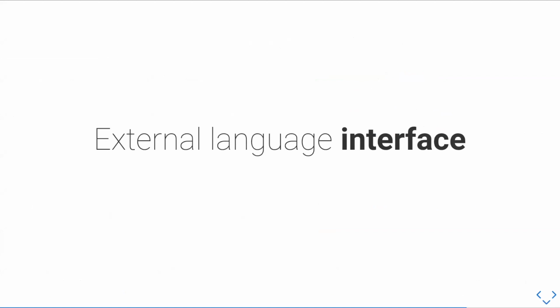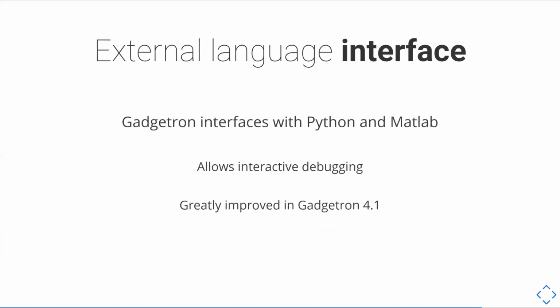Finally, I'd like to talk about the external language interface in Gadgetron, and you'll be meeting that a lot during the online class. Gadgetron interfaces with Python and MATLAB, could be extended for other languages, but those are the ones we support currently. And that allows you to do interactive debugging. So this is Python and MATLAB without any restrictions whatsoever.